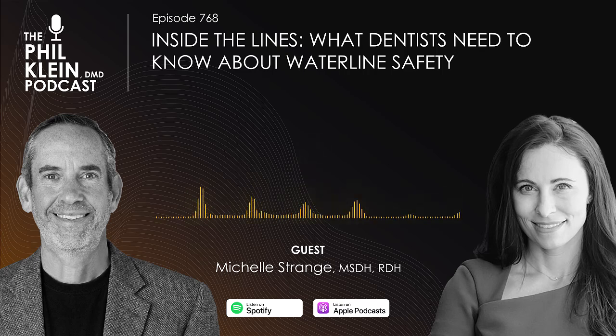Yeah. So when experts talk about proper waterline protocol, like you did in your webinar, they often describe it as test, shock, and maintain. Now, we'll be going through each step, Michelle, but before we do that, give us an overview of why the test, shock, and maintain protocol is so important to waterline safety. Essentially, without doing all three, the office will inevitably fall into an infinite loop of failed test results that exceed 500 CFUs. So tell us about that trifecta that is so critical.